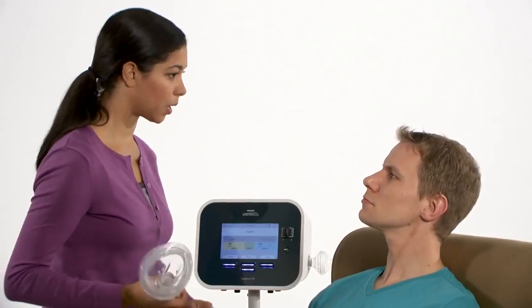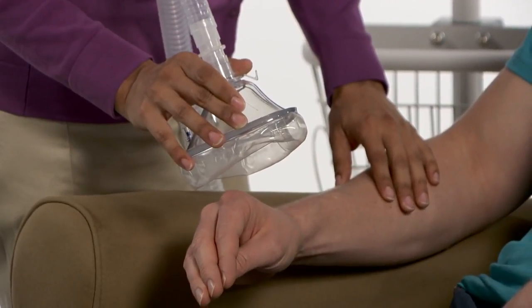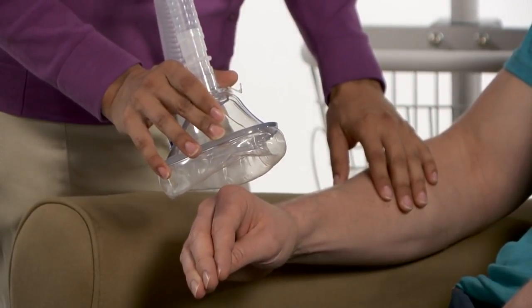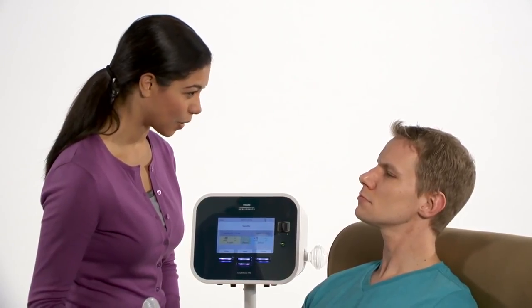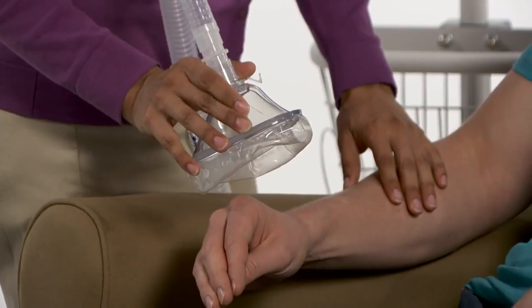Before the first treatment session, it's a good idea to let the patient feel the airflow so he knows what to expect. This is helpful when working with children. Consider giving the patient an opportunity to get familiar with the mask or mouthpiece. You may also want to work out a stop treatment signal in case he needs a break.